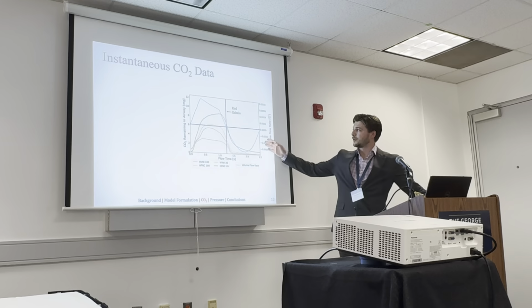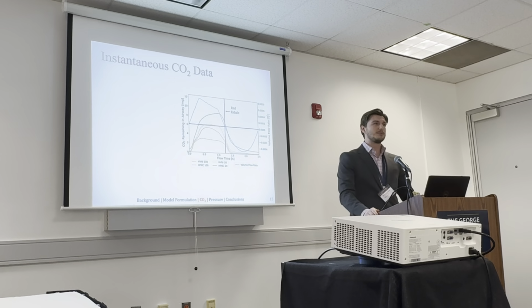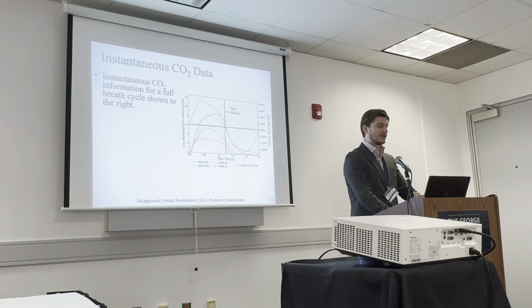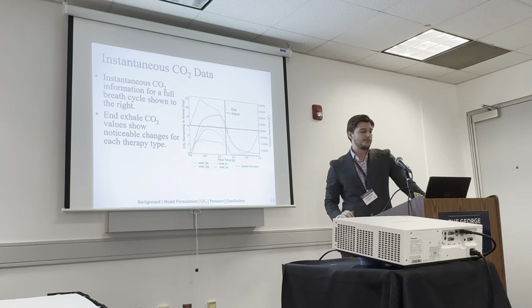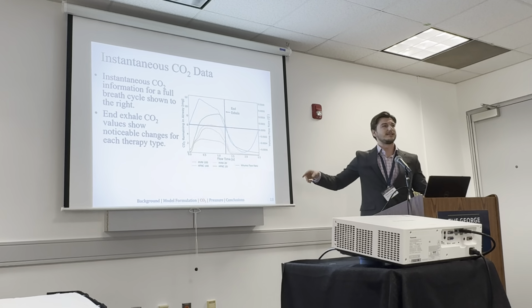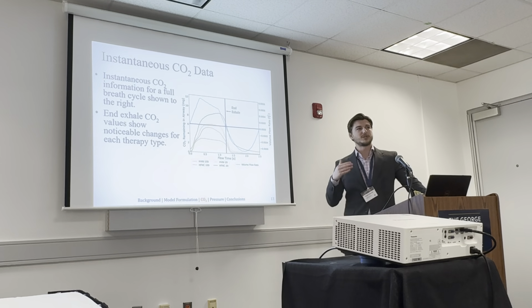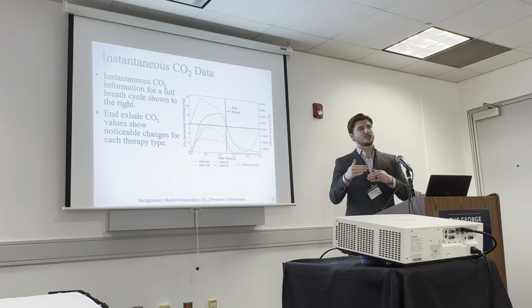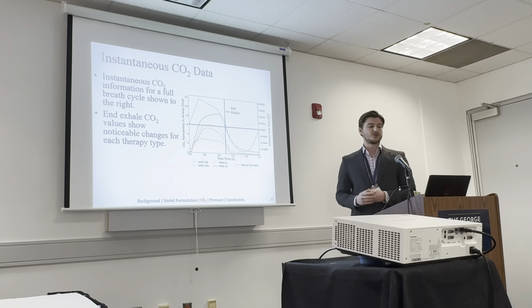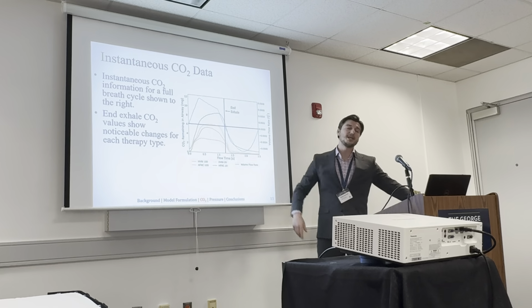When the volume flow rate is 0, that's the transition from exhalation to inhalation, indicated by the vertical black line labeled end exhale. Notice that as the curves cross this end exhale line, there is a significant difference in the variation between HFNC and HVNI as the mouth is closed. For the HVNI curves, you can see the red and the yellow for 100 and 20.